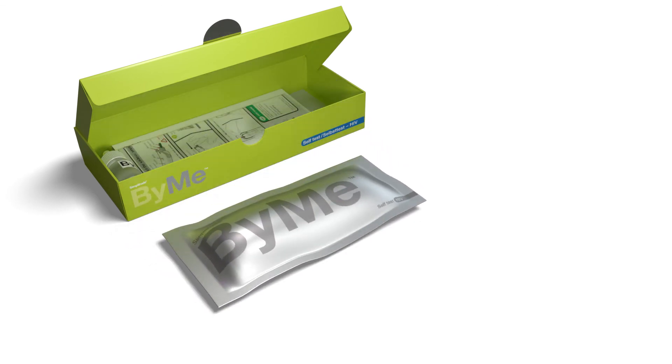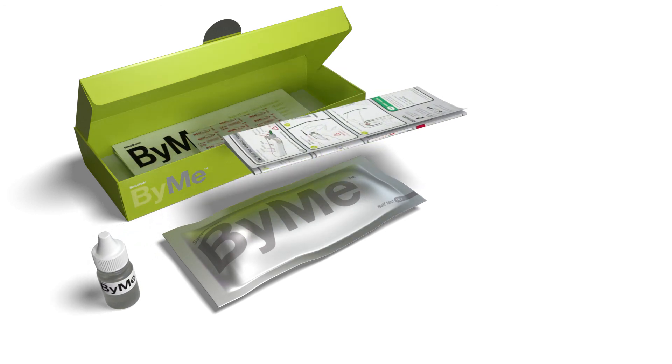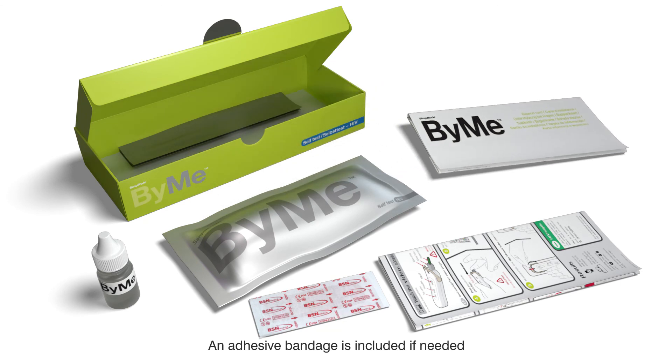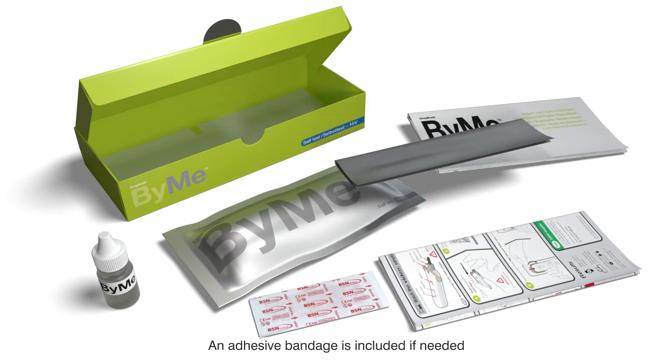Inside the box, you'll find a HIV self-test sealed in a foil pouch and a bottle of test fluid. You will also find instructions for use and a care card to support you before and after you do the test, and a discreet disposal bag.